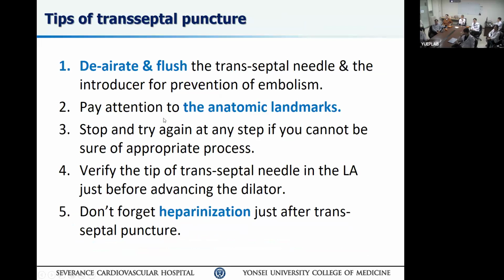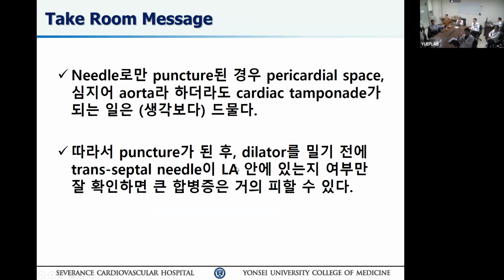This is the conclusion. You have to deaerate and flush, and you should keep in mind the landmarks, and just verify whether you're in the LA or not. Don't push the sheaths or the apparatus into the LA if you cannot confirm you're in the LA. This is the end of the presentation. Thank you.